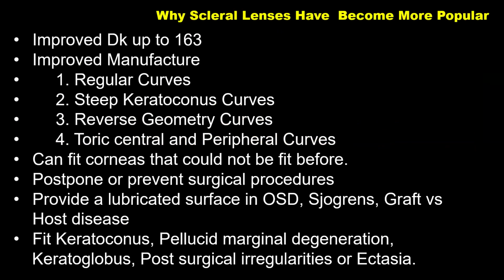Now, because of the features I've mentioned already about the scleral contact lens, and the fact that it has to vault over the cornea, the DK value, which we know as the oxygen permeability value, will likely be compromised, because the distance between the cornea and the external environment is now far because of that liquid interface.